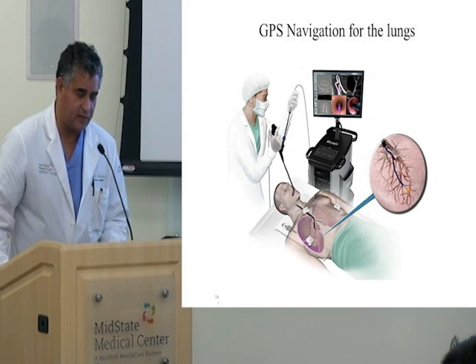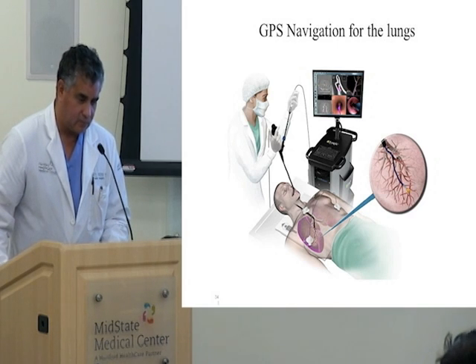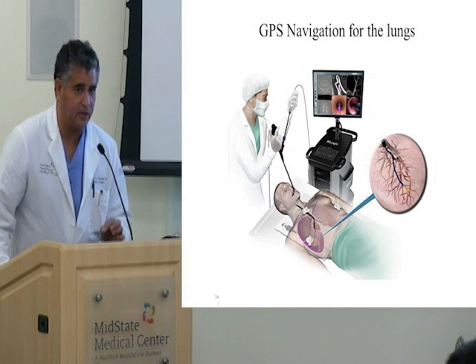The operator stands at the head, the bronchoscope is advanced into the lung. This is the setup that you're going to see with multiple different screens, so you can look at either the pathway or the map or whatever you want.